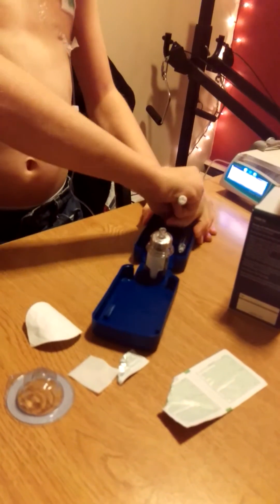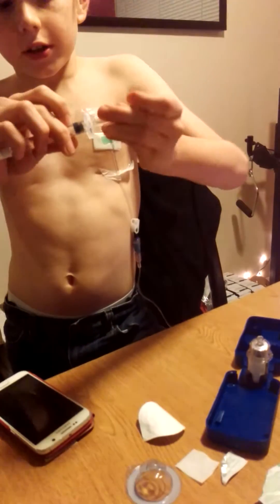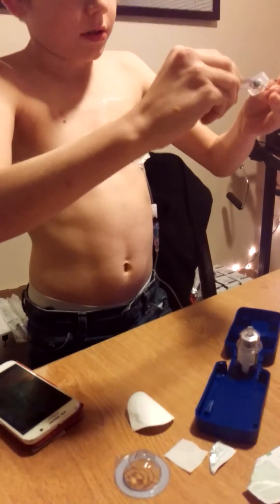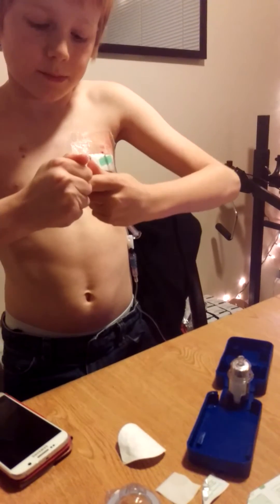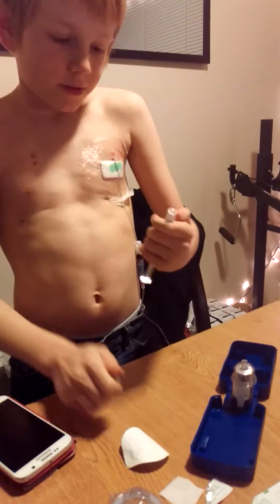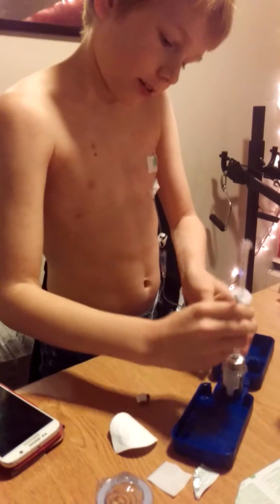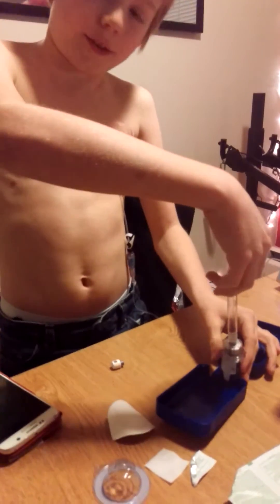That's just beeping because my pump is done. Now take this, put it in here, and then screw it up — well, you don't want to screw it up. Then pull that off, put it on here, and push this through.